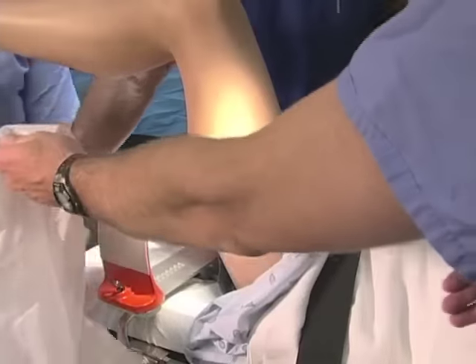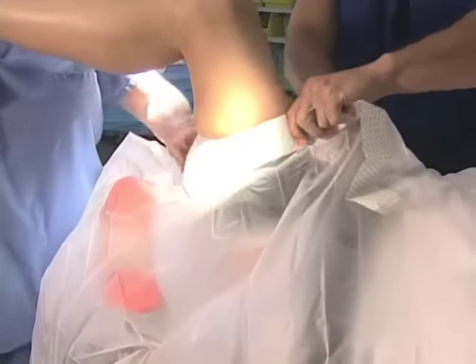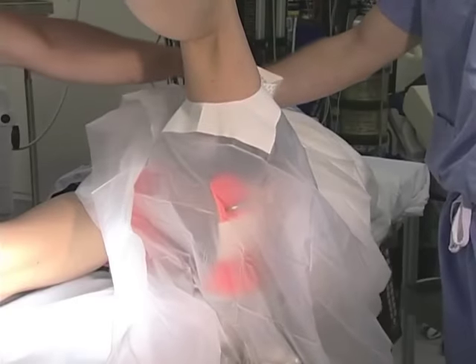Finally, a plastic drape is affixed to the patient's thigh so that the preparation solution does not drip up and under the tourniquet.